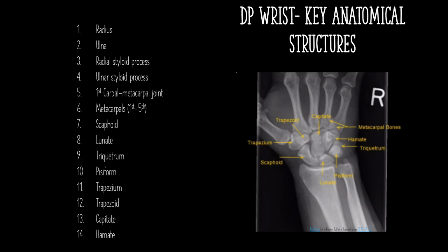It's important to know key anatomical structures when we're talking about wrist imaging. And I have named 14 here, and we'll point them out. So it's very important to learn all our carpal bones, so you can learn your own mnemonic to remember these. But we've got the scaphoid, the lunate, pisiform, triquetrum, hamate, and then we've got the hook of hamate, the capitate, trapezoid, and the trapezium.